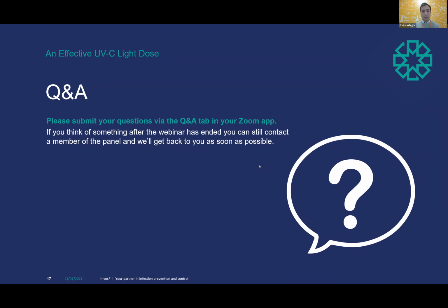And it kind of ties in with another question underneath, your standard exposure time. I guess you could have some sort of standard exposure time. I guess if your system was able to also validate what's happening in the room contemporaneously, that would be even better. But to be able to just advise on a standard exposure time, again, it depends on your challenge and on other parameters that we mentioned before. It depends, for example, if the room has been cleaned beforehand, manual cleaning, etc.